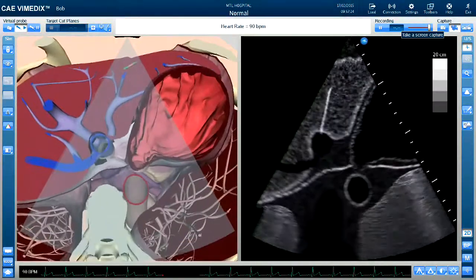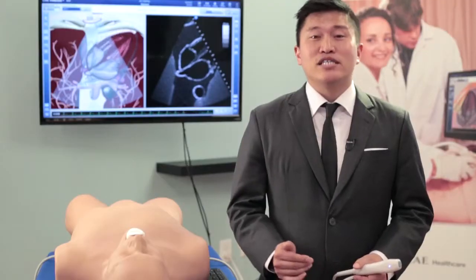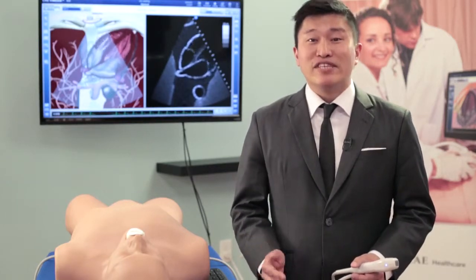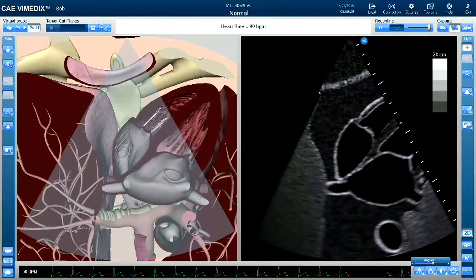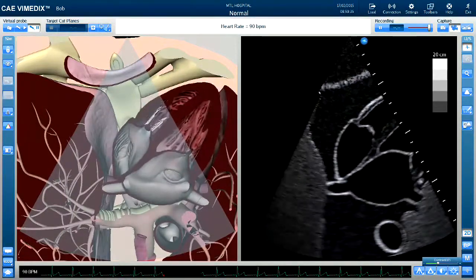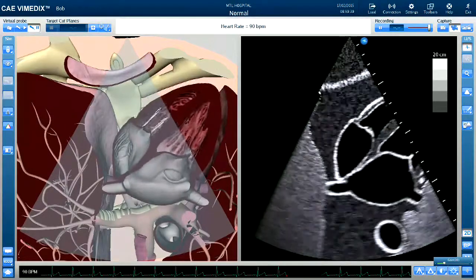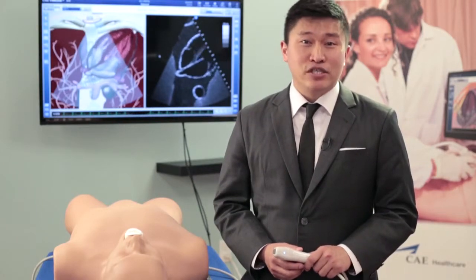The system is designed to simulate both real ultrasound images, as well as contain some features that are useful for instructors and for trainees. On the left-hand side of the screen, you see our augmented reality system as well as some teaching tools. On the right-hand side, you see a simulation of the ultrasound image with all of the tools and functions that you would need for a real ultrasound machine. All of the controls that you would need to use on an actual ultrasound machine are simulated on the Vimedix simulator.